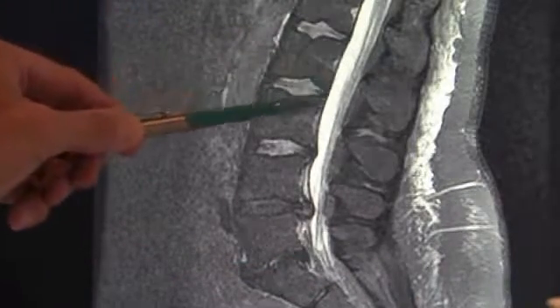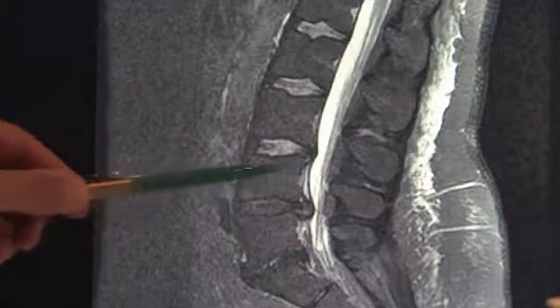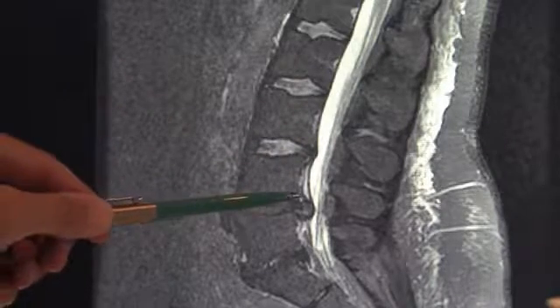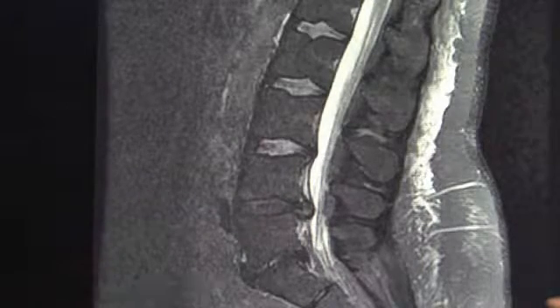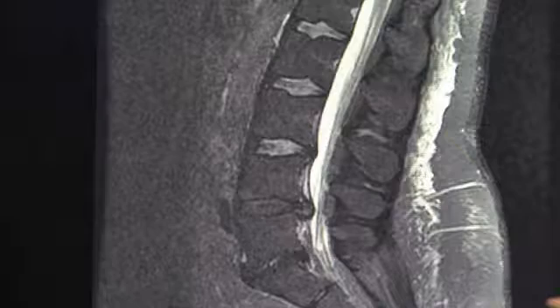This is the spinal nerve roots and the spinal fluid. You can see here clearly that there's a disc herniation coming out here between the 4th and 5th vertebra, pressing on the nerve roots there.